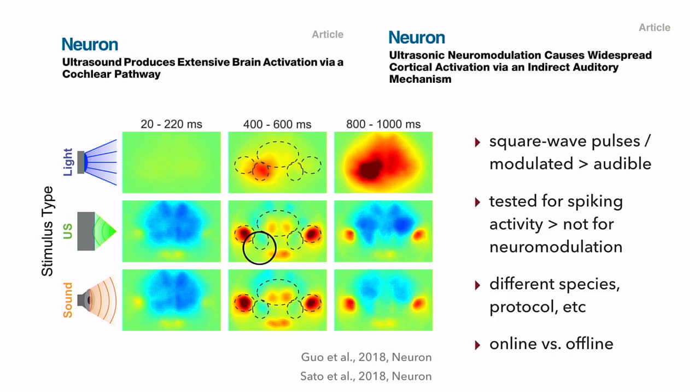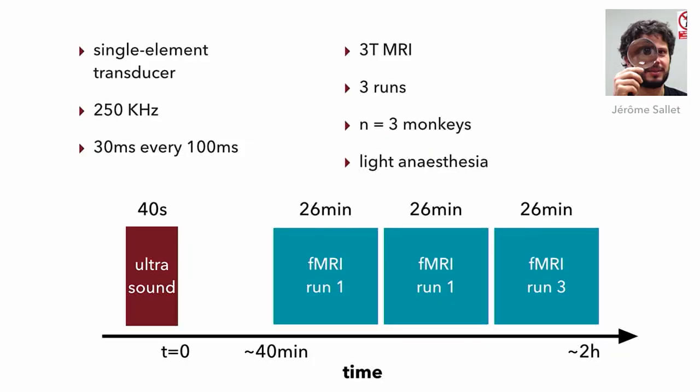And perhaps important for the studies I'm going to present here, I'll be looking at a different species, primates, namely macaque monkeys. And most critically, nearly all studies on ultrasound so far have focused on the online effects during the stimulation or immediately afterwards. We were really interested in the offline effects. We thought if there's any potential to develop this as a therapeutic tool and even as a research tool, it would be critical to show that the effects of ultrasound, the neuromodulatory effects, outlast the stimulation. So that's what we set out to be doing.